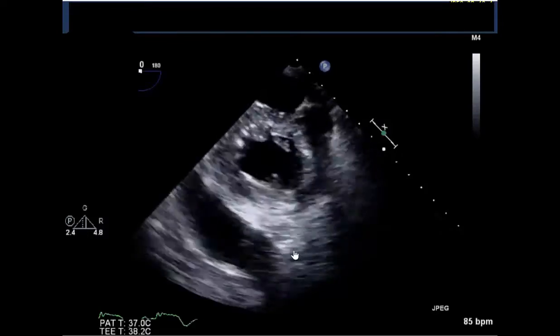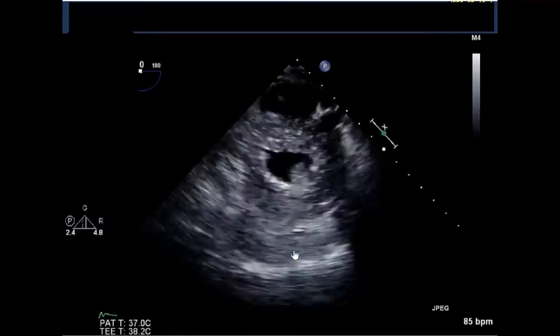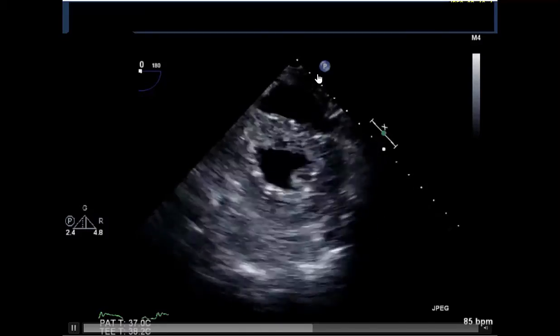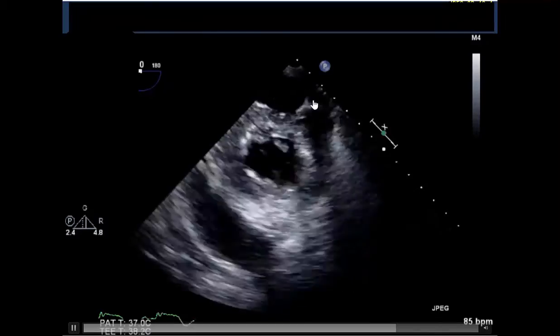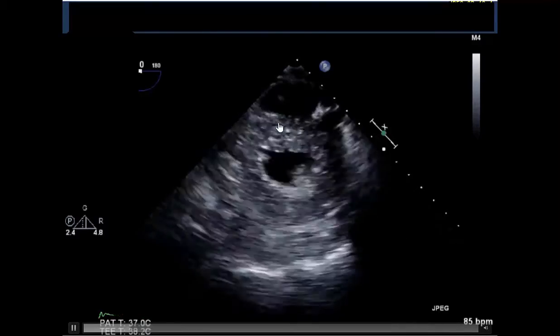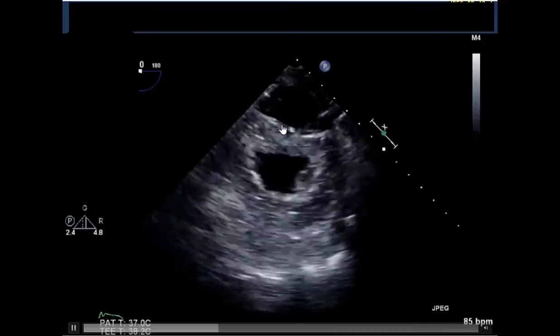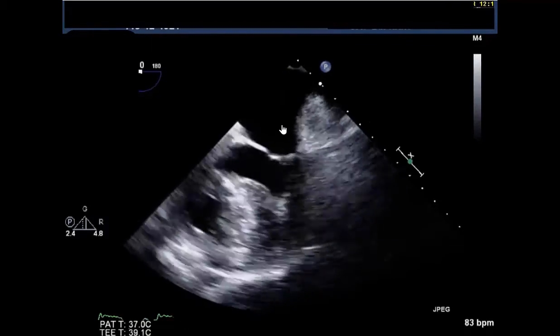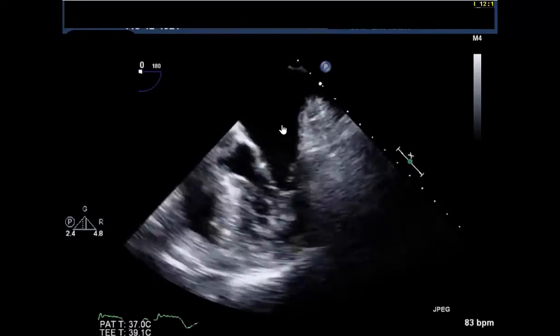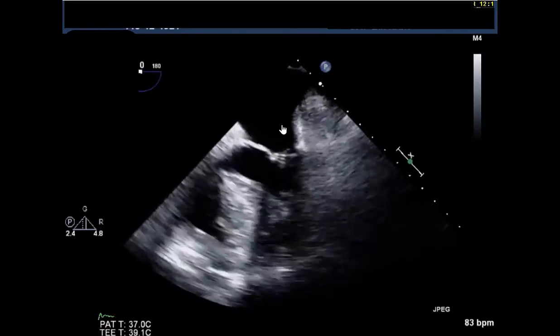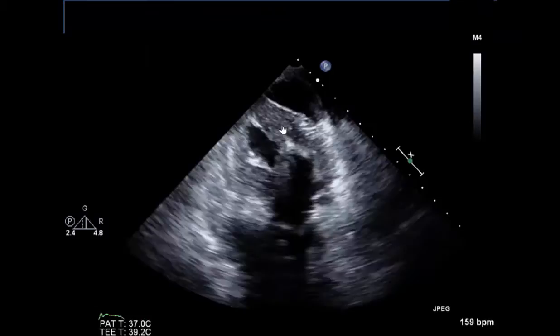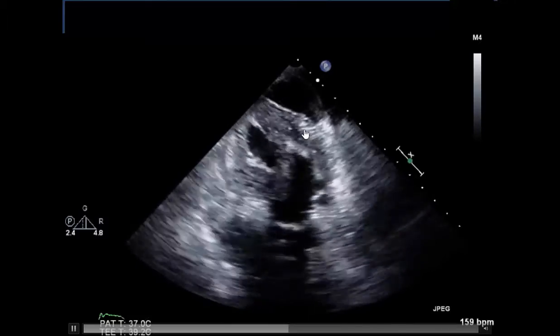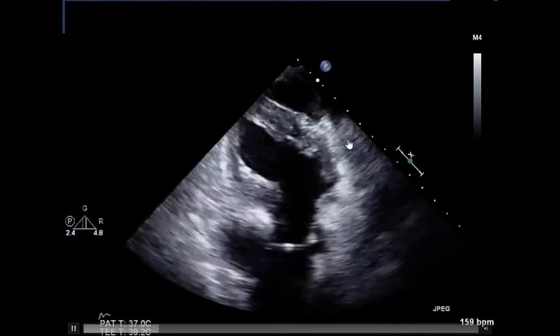At that point, we intubated the patient because he was having chest discomfort and performed a transesophageal echocardiogram, which showed a loculated collection of blood on the posterior lateral wall, consistent with the space seen on angiography. However, overall function was normal. There was no compression of the RV and no compression of the left atrium, which is sometimes seen with perforation in previous bypass patients. There was a loculated hematoma preventing expansion of the lateral wall.